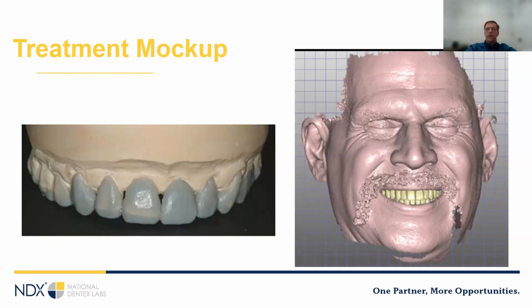One nice thing about these PMMA overlays is that we can bond into place and then just prep right through them. The one challenge is when we're doing crown lengthening. If we're going to just put the mock-up in and let the patient see it in the office, then we can go ahead and just overlap the gums. But if we're going to bond it in place, we can't do that because, of course, we have to make the case hygienic. So sometimes showing that crown lengthening can be difficult or nearly impossible with a bonded restoration. So you'll need to work through that.